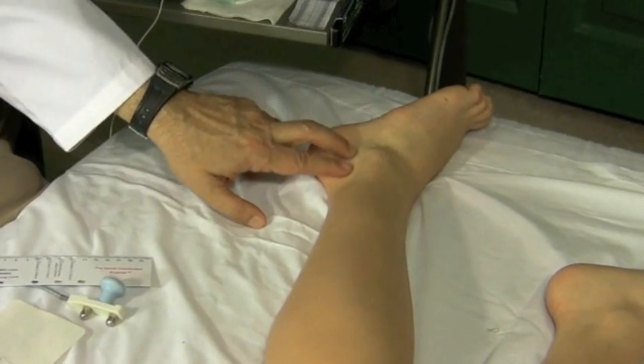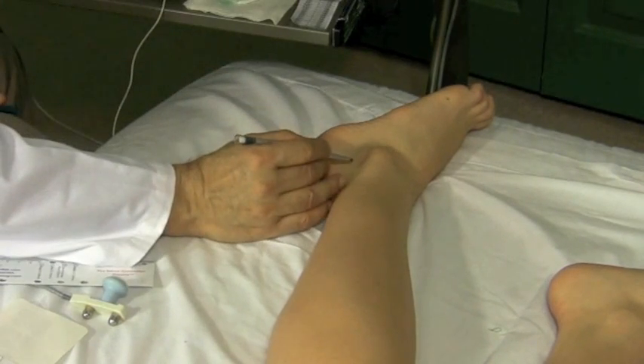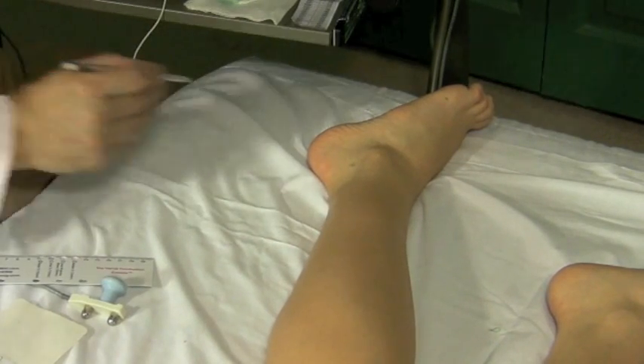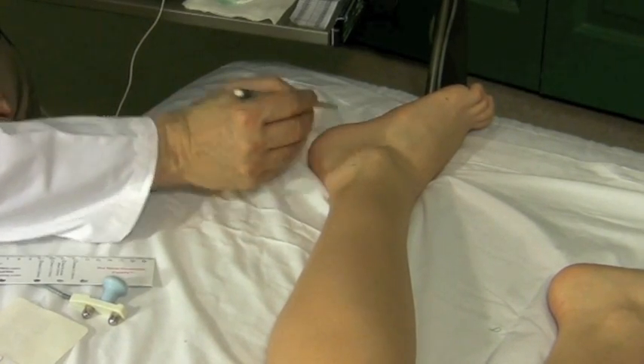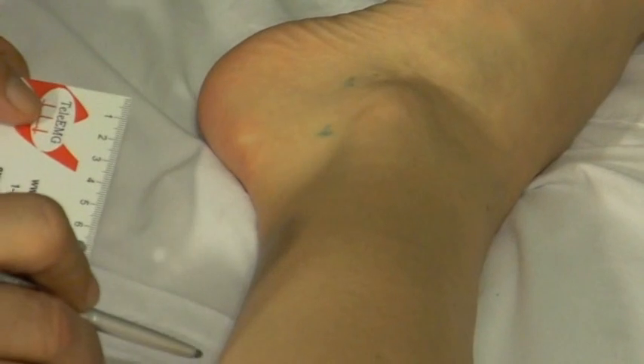I'm going to measure it right here. I put the points where I'm going to put the active electrode, the black, and the reference electrode, the red. I measure 14 centimeters from the active electrode up to the calf. This is marked here — 14 centimeters for sural nerve. And I mark up the spot where I'm going to stimulate the sural nerve.